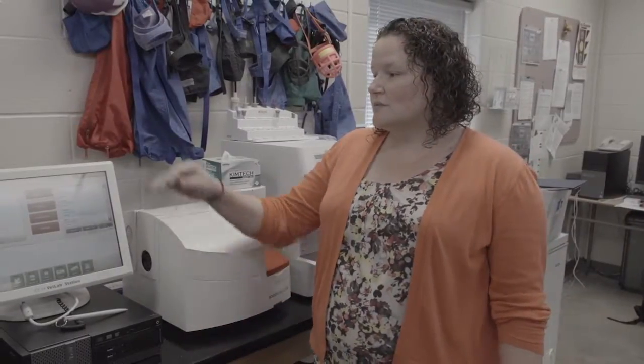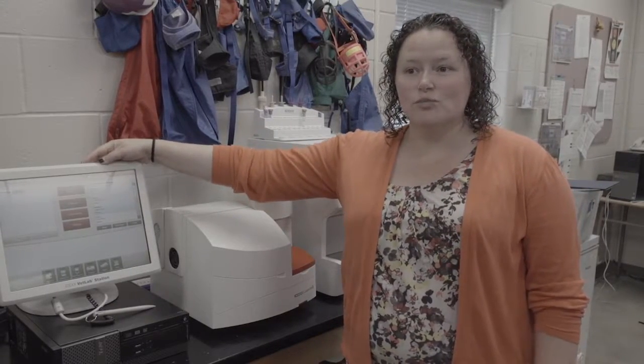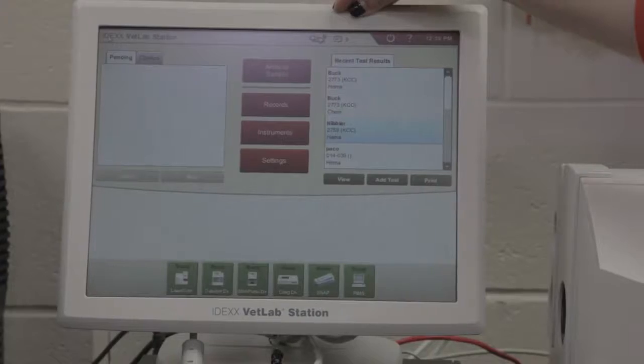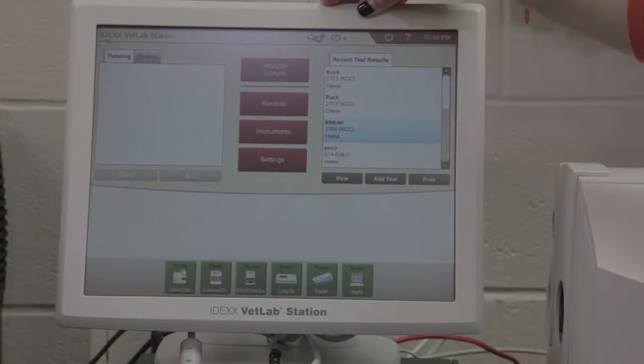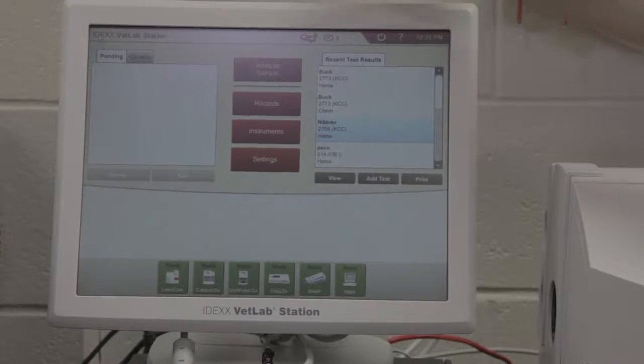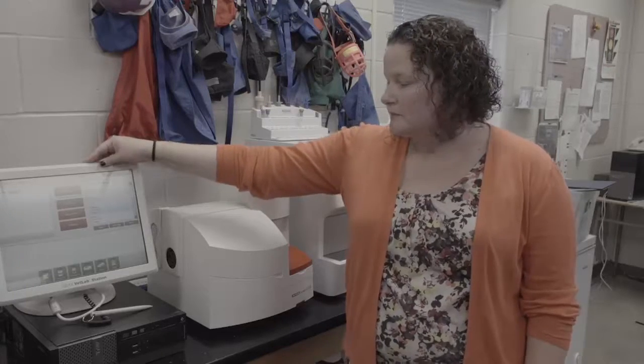So first things first, I'm going to introduce you to each analyzer. This is your IDEXX Vet Lab station. This is the brains of the operation. This is where you're going to start all of your runs from. You will enter all of your patient information on here and then choose the analyzers that you wish to run, and then they will transfer back into AVImark once they've been entered into here appropriately.